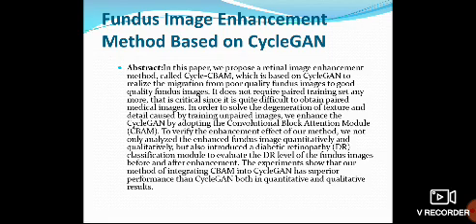The experiments show that our method of integrating CBAM into CycleGAN has superior performance over CycleGAN in both quantitative and qualitative results.